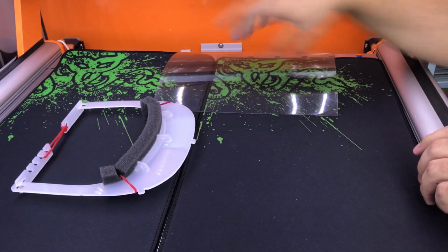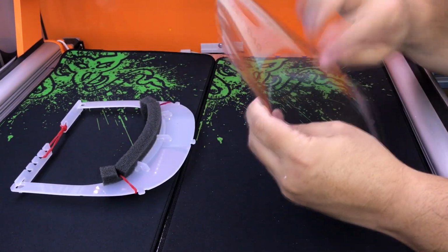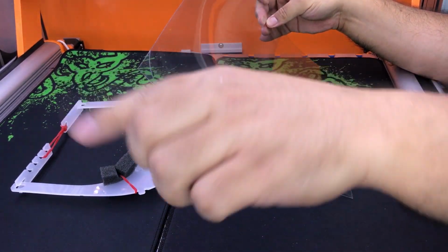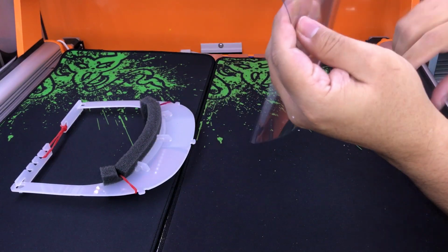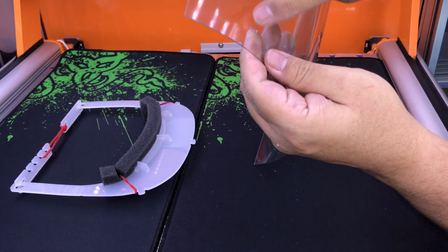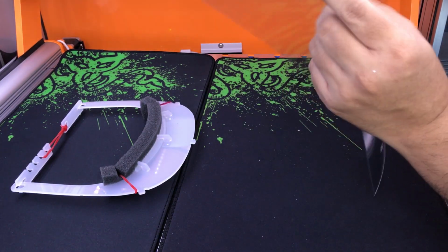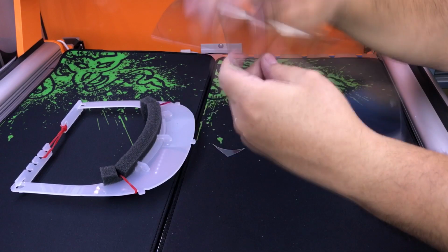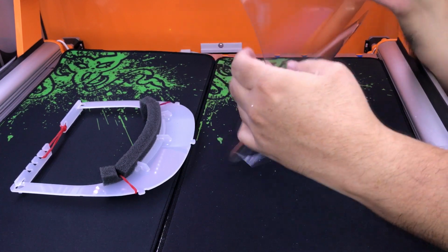Okay, now the plastic cover, the PET cover. The designer also makes two covers at the same time, and makes this cut on the center, and makes these little holes here to hold it. The holes have a special design with two small cuts on the side and one small kind of circle in the center. It's a rectangle with round edges. And this part is very simple. You just make this and remove it. And you have the round edge here.